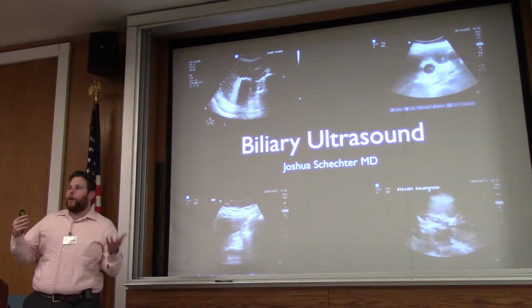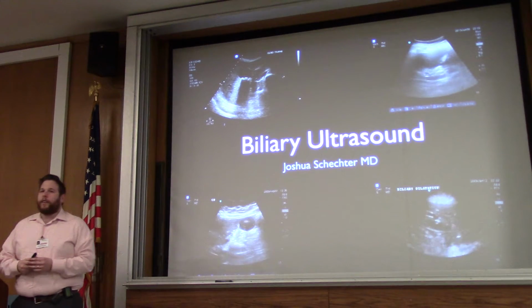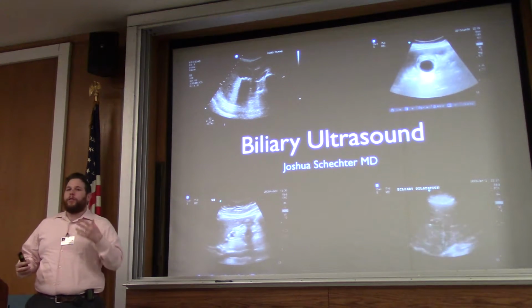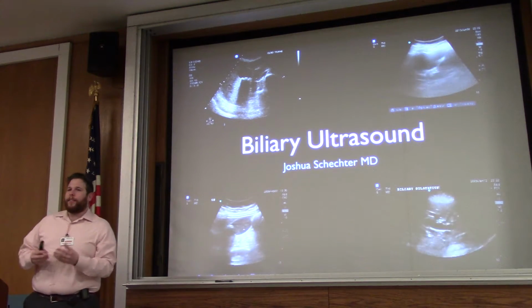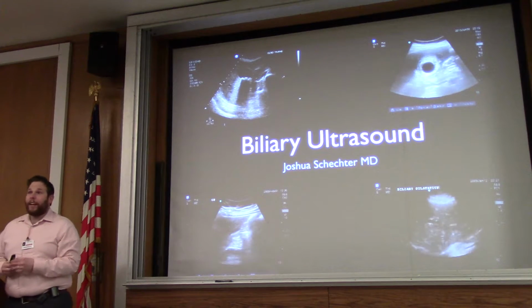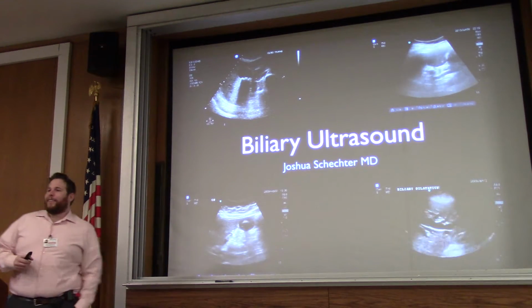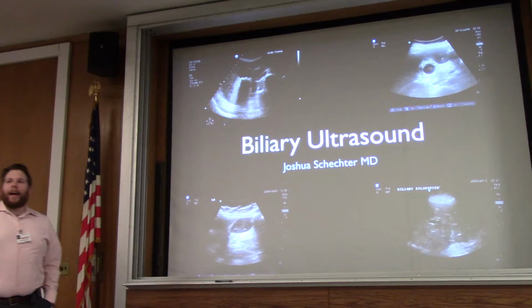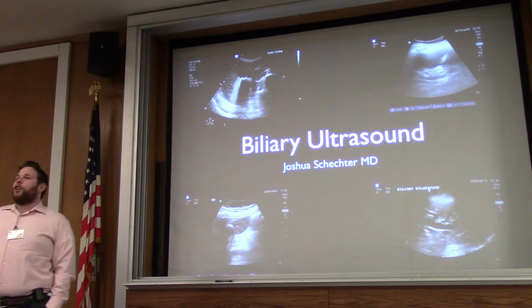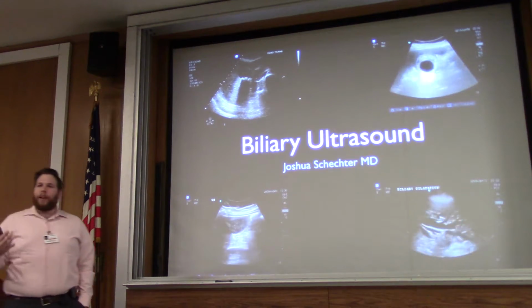I think it's something we do every day in the clinical area. Some of you are pretty comfortable with it. Some of you think you're pretty comfortable with it. Some of you have no idea, and when they say, oh, we'll just do a gallbladder ultrasound, you just nod and smile and go into the room, put the probe on, and pray that you see a gallbladder.